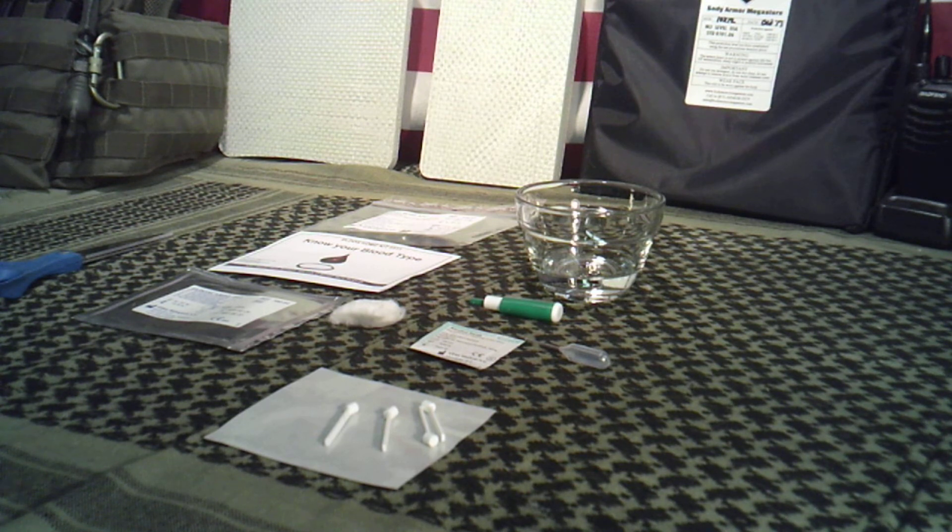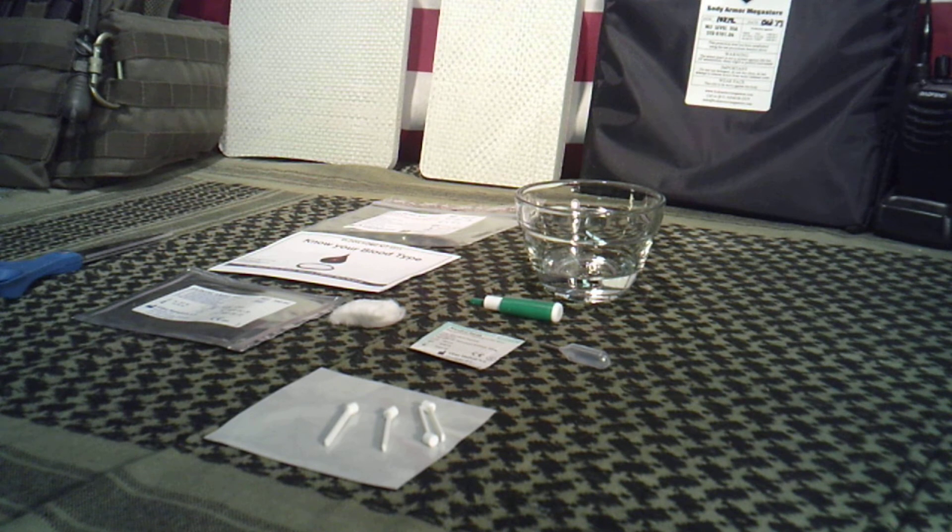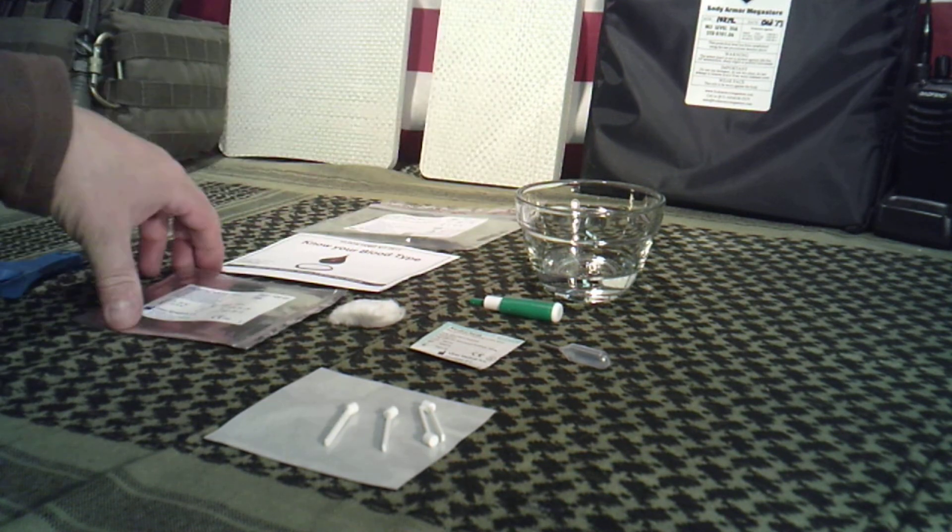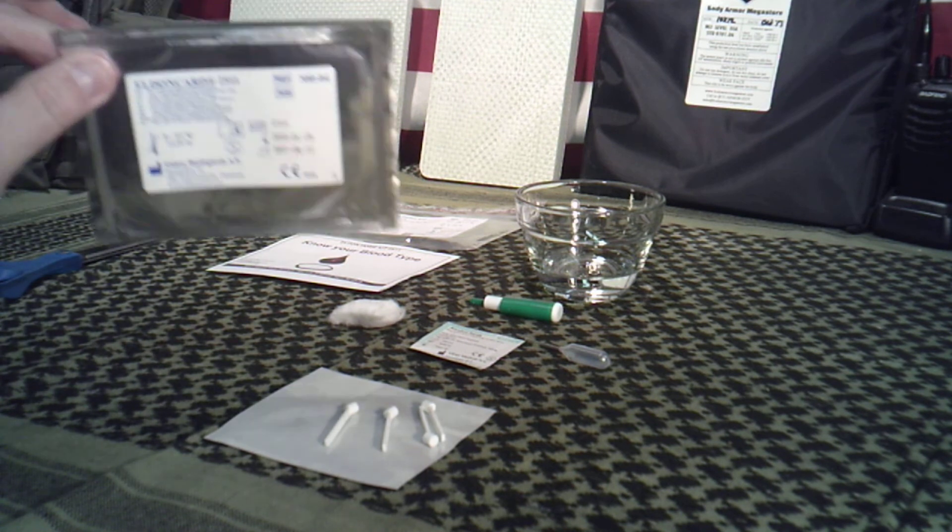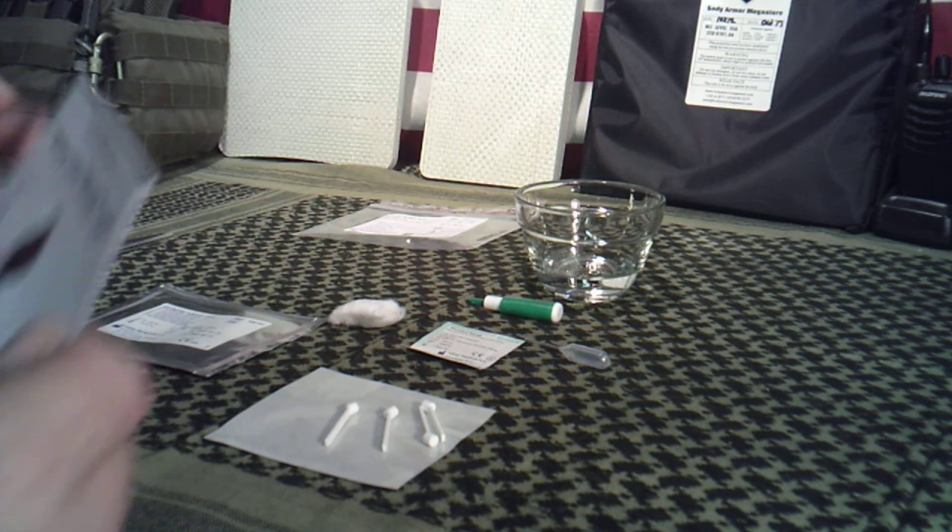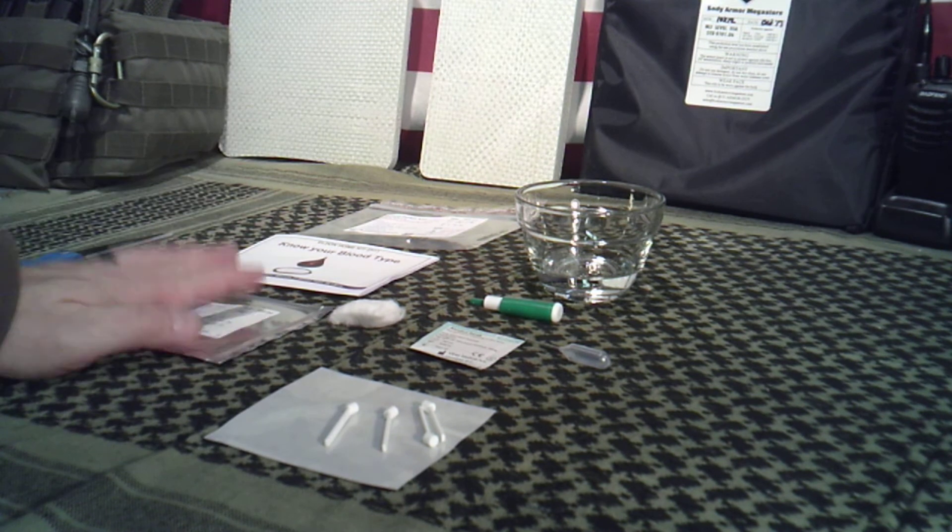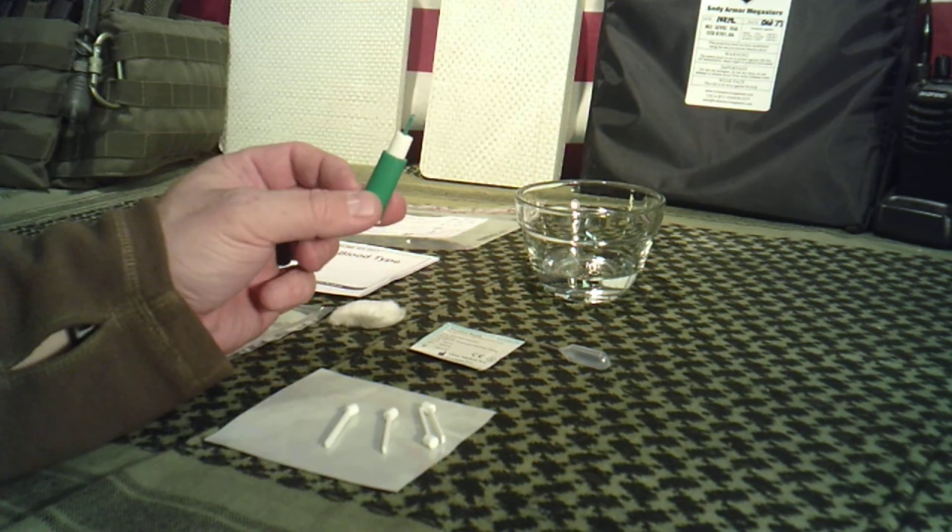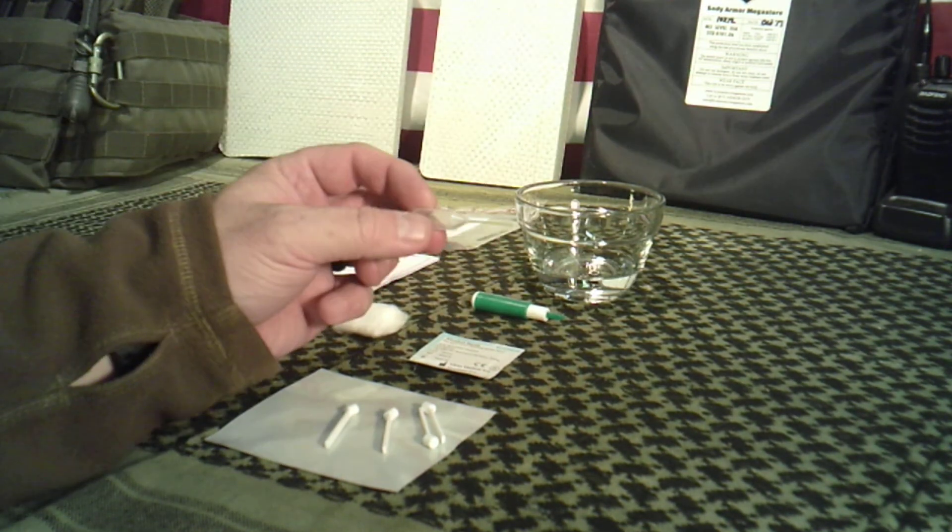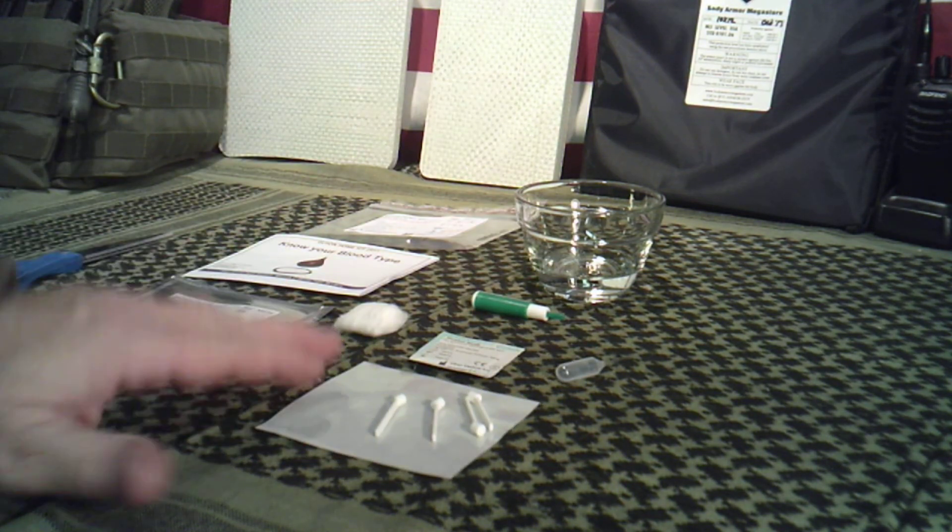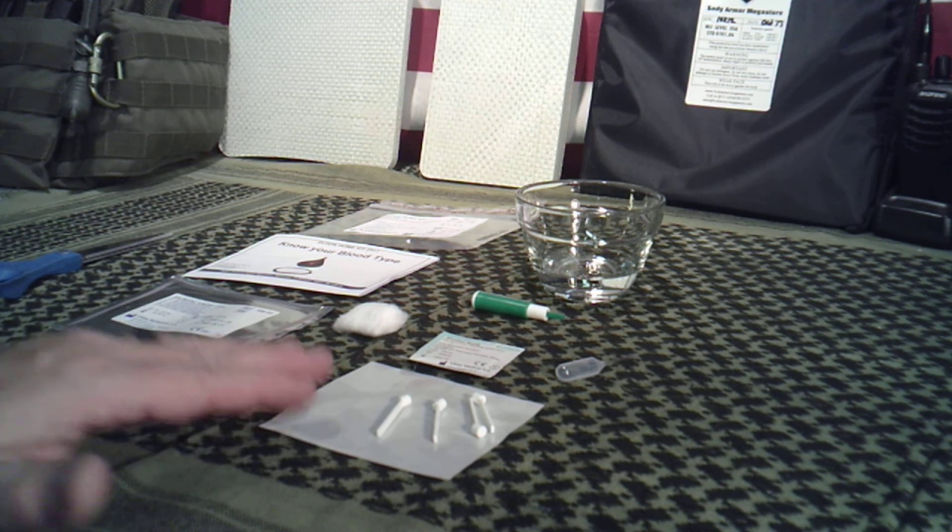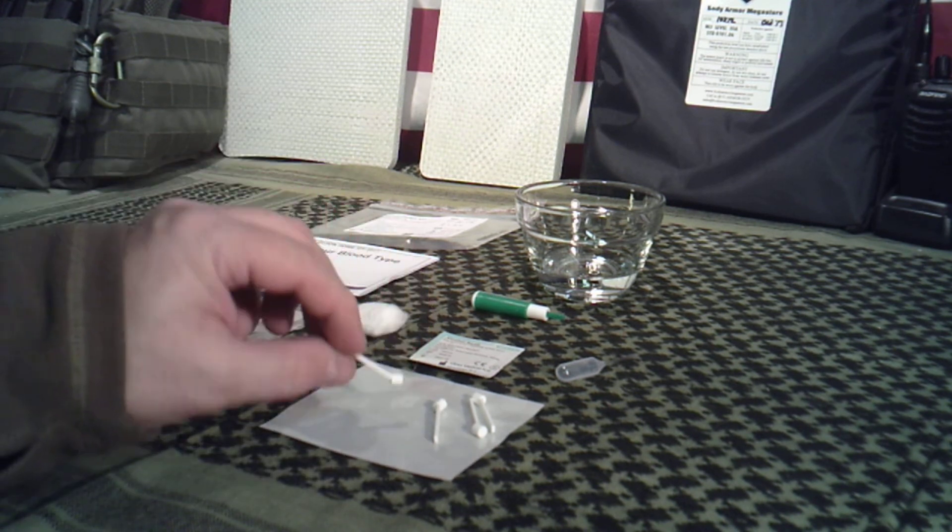One thing that I didn't know was my son's. I bought some of these test kits, I tried it out on myself earlier just to see if it was accurate, and it was. I'm going to show you what the test kit looks like. What you're going to get is going to come in one of these little plastic bags here. This is the actual blood typing card, so be careful with this. You'll get a set of instructions and all the information about the kit. You're going to get a lancet that actually pricks your finger, an alcohol swab, cotton ball. This is a pipette. Then a little piece of paper here to keep things neat and clean, and these are the applicators for the blood itself.